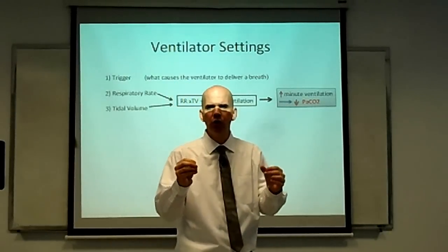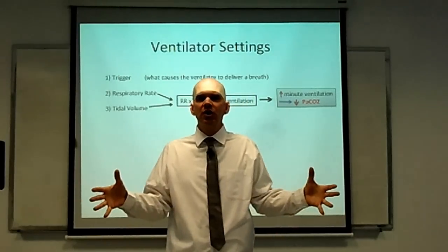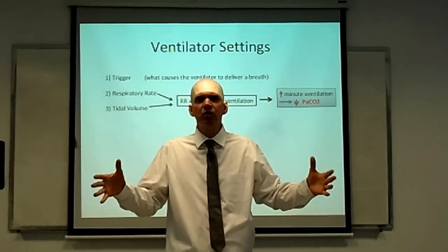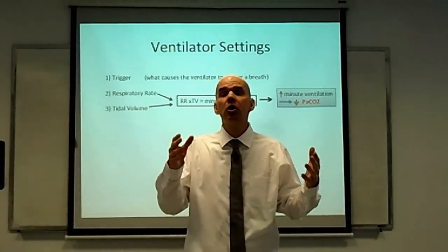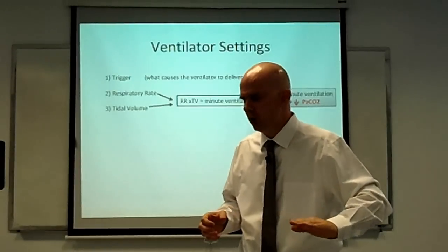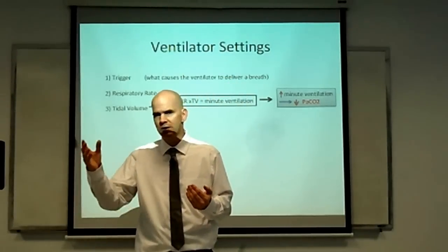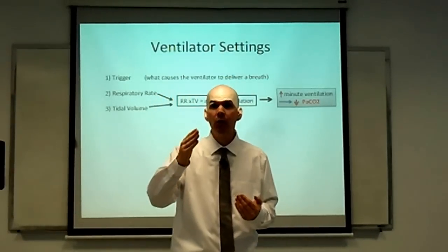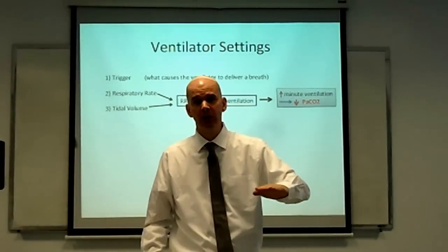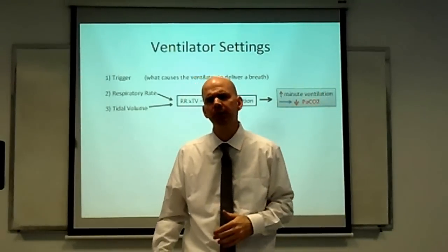It was found, though, that these large tidal volumes ended up causing too much distension of the lungs, too much maximum stretch on the alveoli, and this caused barotrauma. So now we keep the tidal volumes low, down to 8 milliliters per kilogram of ideal body weight. So our 70 kilogram patient, now we would be talking 560 milliliter tidal volume, down to half of the liter that we would have been talking before.